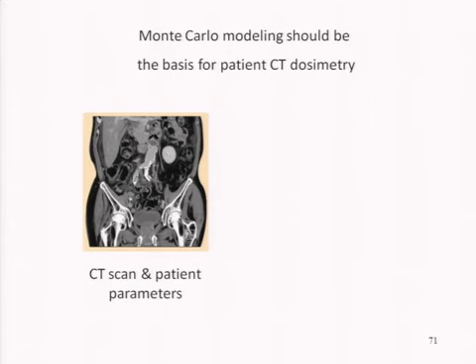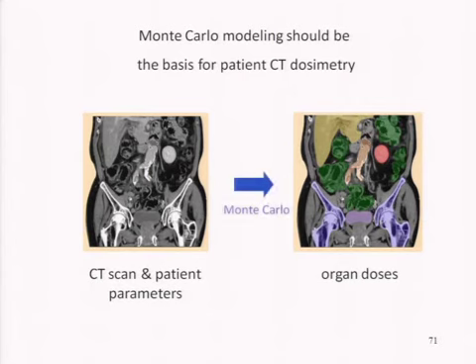It is a metric that we measure, but we can use these data to facilitate Monte Carlo-based measurements, which is the basis of all modern X-ray dosimetry and gamma-ray dosimetry, not only for CT, but for fluoro and radiography and mammo as well. We all use Monte Carlo-based tables for these, and it's refreshing for those spirited individuals who actually make the physical experiments so you can validate the Monte Carlo, but ultimately there are too many parameters to do physical measurements, and we all rely upon Monte Carlo-based tables.